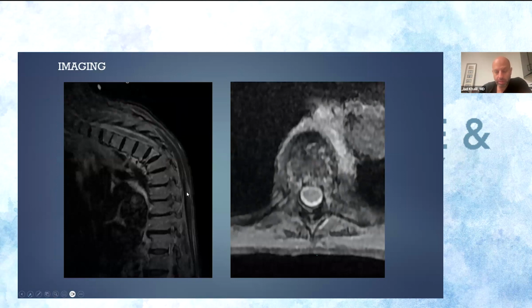And the reason I chose these fractures is that in my opinion, this is not amenable to a balloon. Whenever you see that pancake vertebra, typically the balloon will squirt either anterior on the disc space or not exactly where you want it. This is where you need that. And my disclaimer here is that I still do tons of balloons whenever the situation does not need a SpineJack.